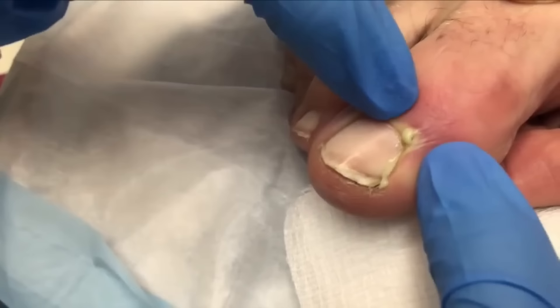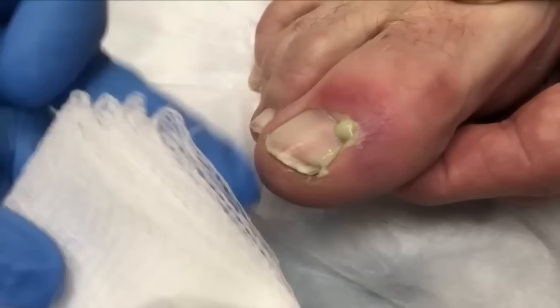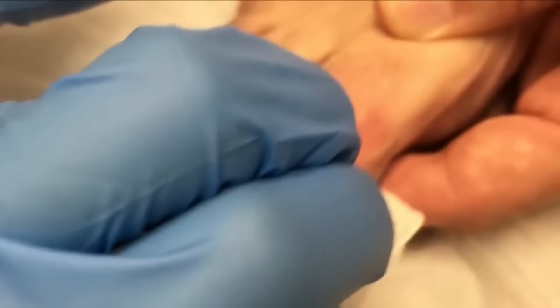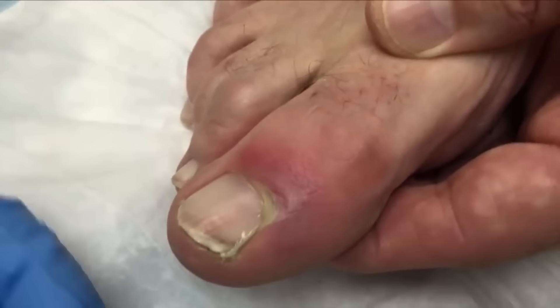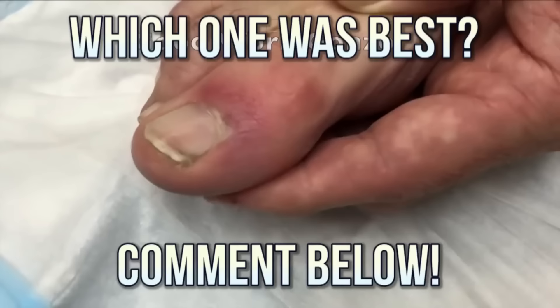Probably didn't even need the cold spray. Good job. This started six days ago from power walking at lunchtime. I think that's going to be good — we'll just put a band-aid on there. We don't need to stick with the doctor anymore.